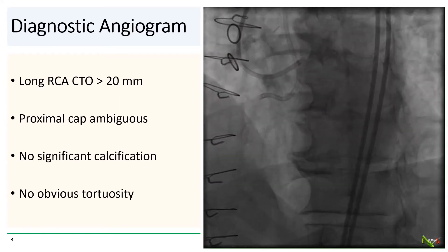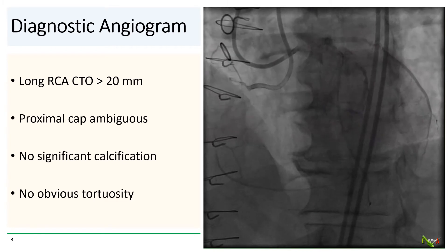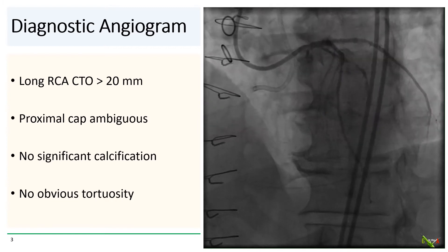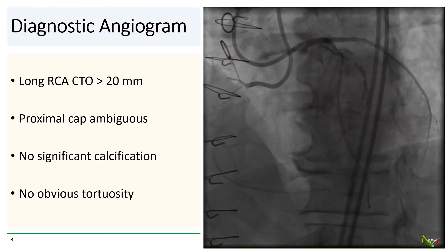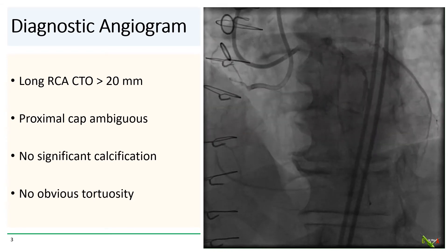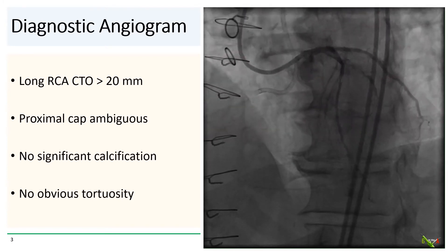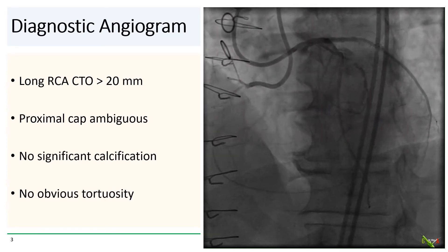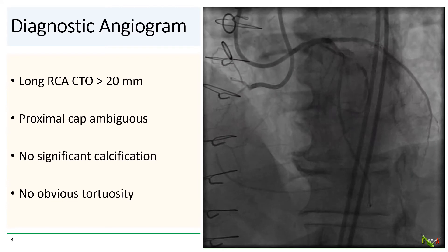As with most CTO interventions, we did simultaneous injections in both the antegrade direction via the RCA and in the retrograde direction via the left main. We see a severely diseased RCA system with a relatively long CTO. The location of the proximal cap is a bit ambiguous. There was no significant calcification in the RCA and no obvious angulation or tortuosity, although you can't be sure about the actual path of the occluded segment without a CT, which was not done here. Sometimes getting a coronary CT before CTO PCI is useful for this reason.